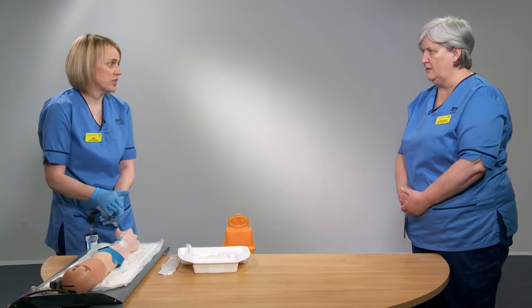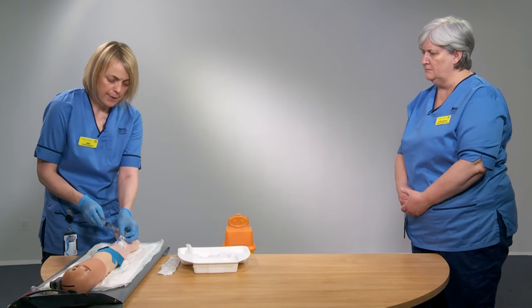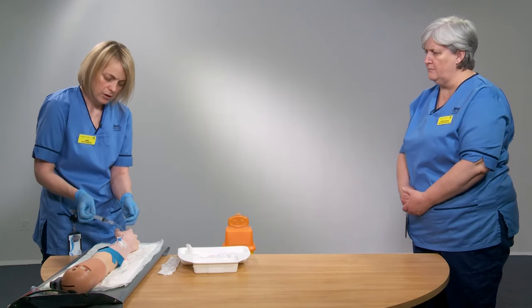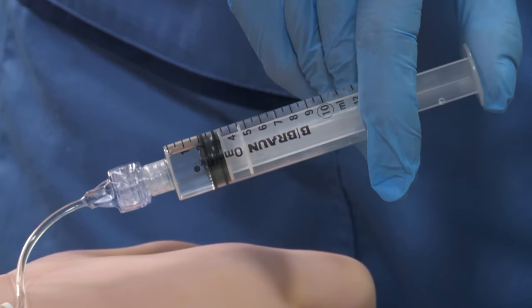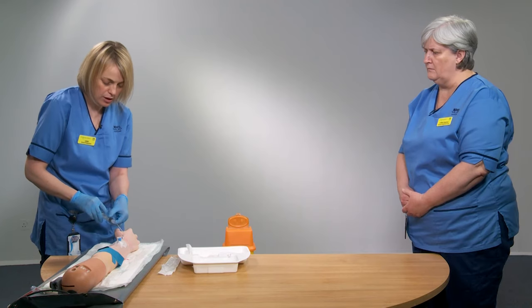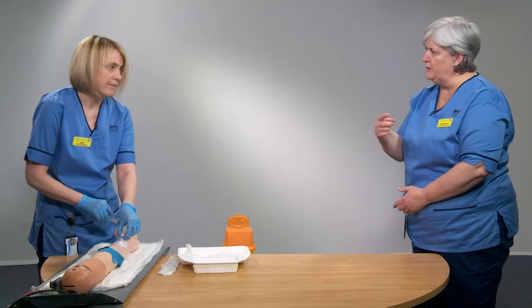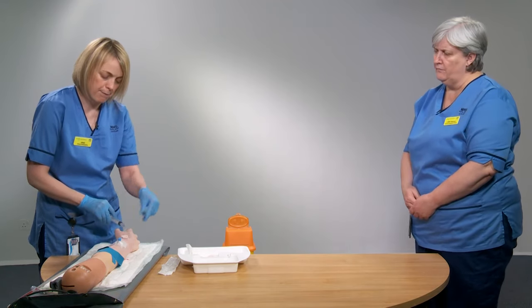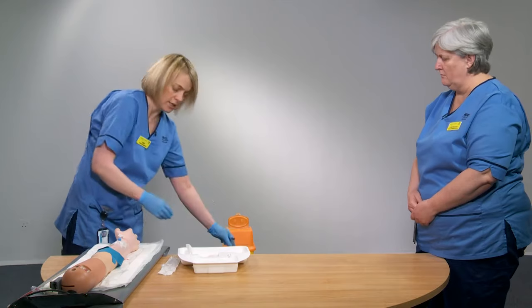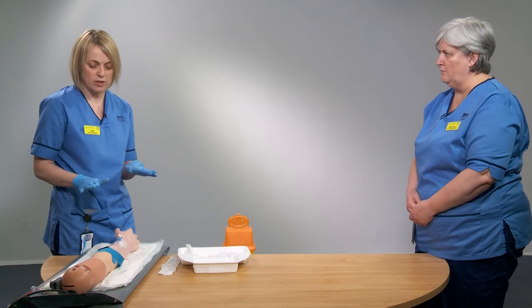The last thing we want to do is flush the device. The needle-free access device is already primed. Unclamp it and use what we call a push-pause technique: push in half a mil, then stop; half a mil, stop — that creates a positive pressure and a turbulent flow for flushing the device. Then pop the clamp over and disconnect your syringe. The flush should go in very easily; if you feel any resistance at all, there's an issue with the cannula and you should go back and reassess.